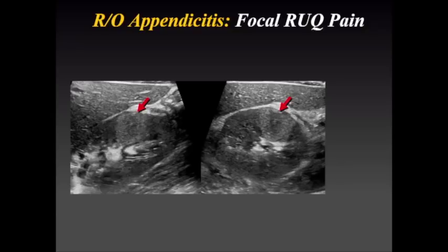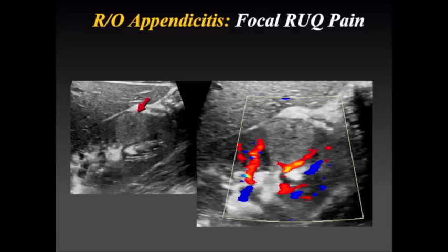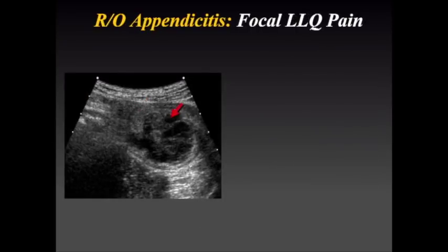And as Mindy so beautifully showed, this patient pointed right to the right kidney. There is a lobar area of increased echogenicity, a little fluid adjacent to that right kidney. And remember, the endotoxin of E. coli activates complement in the microvasculature, causing microvascular sludging. And so acute pyelo is, in fact, an ischemic lesion, often seen with a little adjacent free fluid. So pyelonephritis as well.